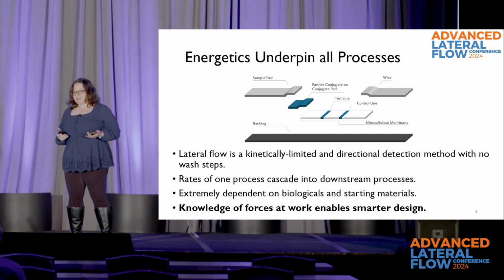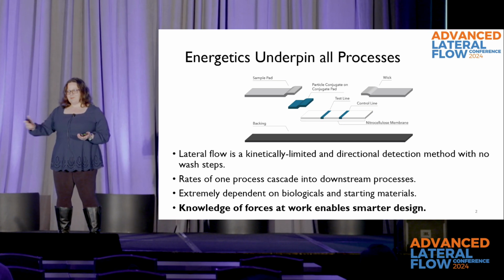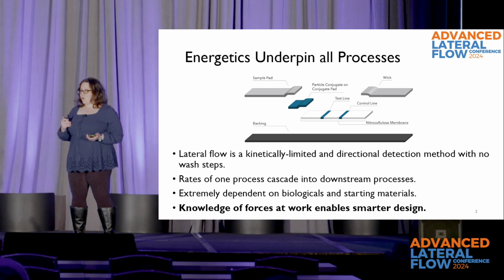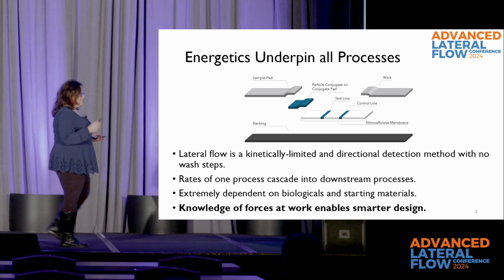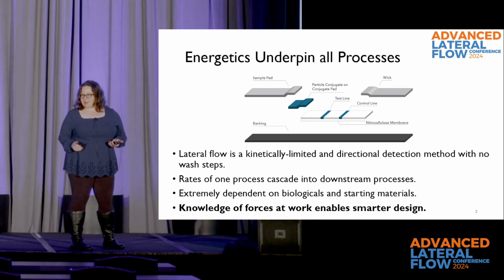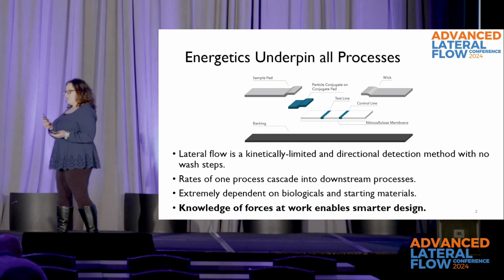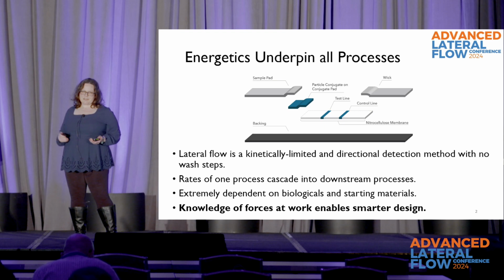And the problem with the lateral flow as opposed to an ELISA is that, first of all, it's a directional flow. There's no mixing. There's no mixing at 37 degrees. There's no 1 hour for each step. There's no washing. And finally, at the end, there's no big enzyme coming in and making that wonderful signal that you then have to stop and read on a plate reader. For lateral flow, you've got sample going on. It's dirty. Maybe it needs filtration. You have directional flow. You've got release of the conjugate, and you've got one shot past that test line.